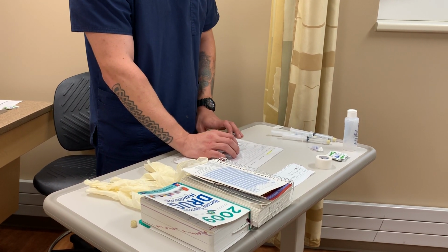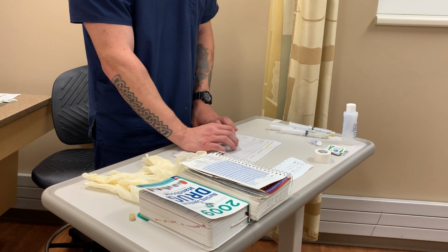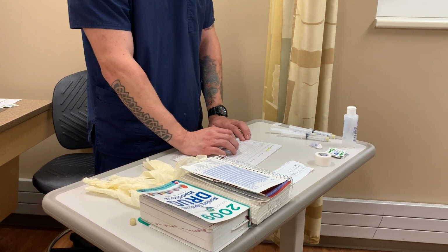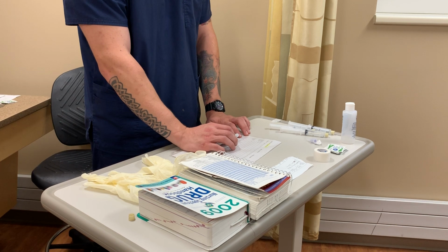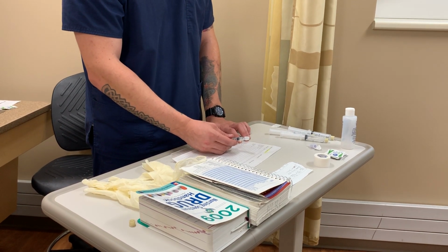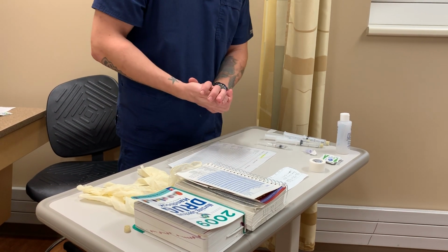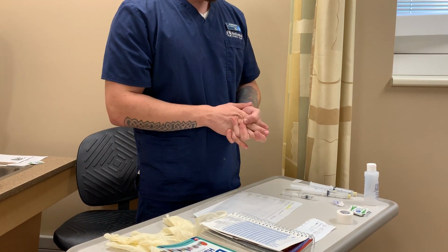Morphine sulfate, 7 milligrams IV push every 3 hours, PRN for pain for Jennifer Doe. We have morphine sulfate, 10 milligrams per 2 milliliters, which equals out to 1.4 milliliters for the dose for Jennifer Doe. We note here also that she does not have any allergies, and we will be checking when we head into the room. So we are ready to dilute this medication.